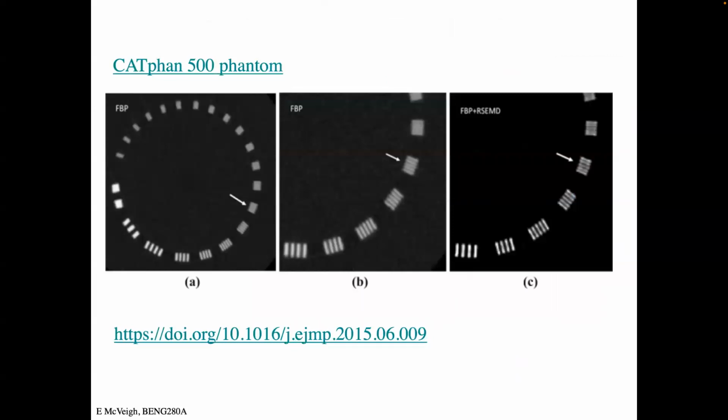Phantoms are designed such that you can just put it in and visually look at the output image, and measure what is the highest spatial frequency available, right? So here you can see as we go around this arc, interestingly, the arc is at the same radius. We can't put all of these things at the center of the scanner, so they go along, but at the same radius. And the cycles per centimeter goes higher as we move along here.